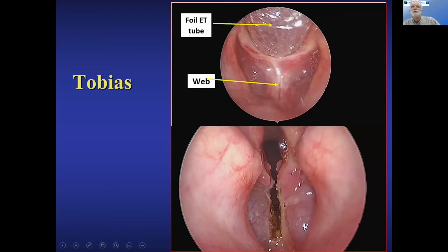This was an endotracheal tube with a foil around it because we were going to be lasering. You can see the results opening up and how much of that glottic lumen was open by just doing that. That was our one dog, and that was three to four years ago. The dog is running like crazy. He's doing well now. It had been doing well.